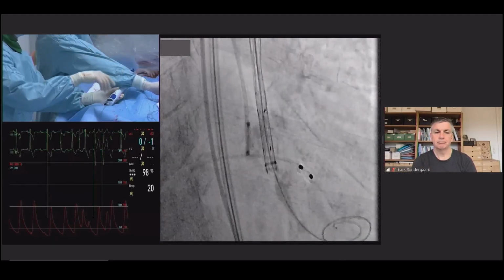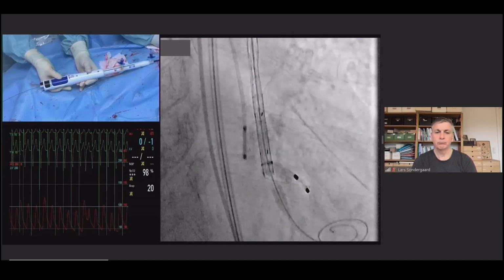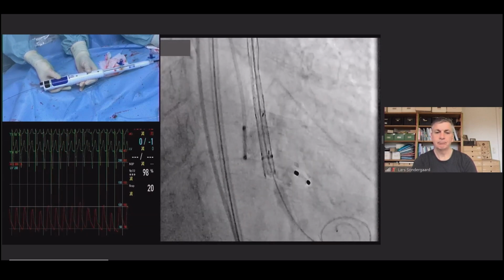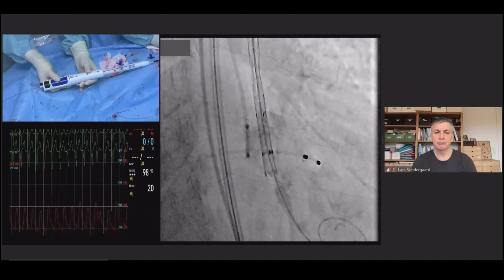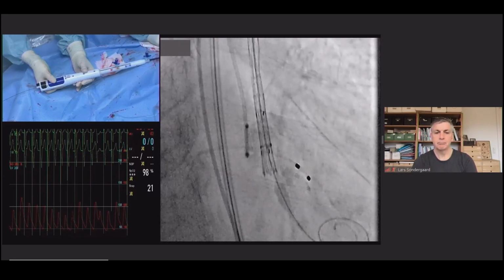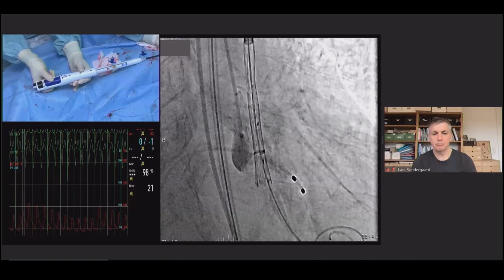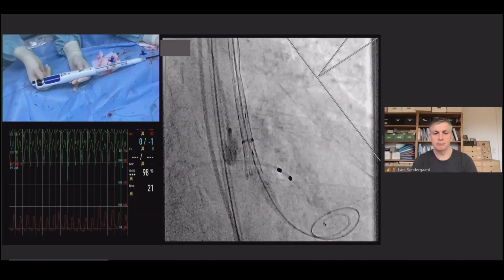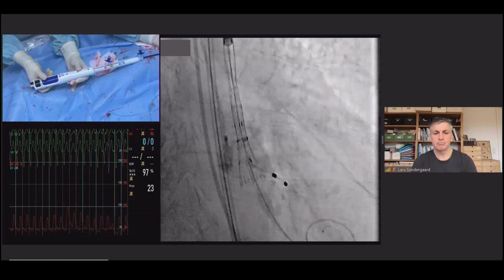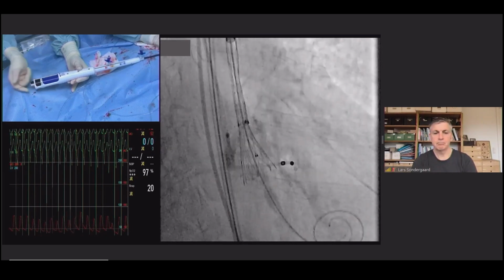Okay, that's fine. Just continue pacing here, and we'll pace a little bit faster when we come to the middle phase where the stent frame is flaring out, before we get annular contact. So you can go up to 130 here. One small contrast injection, you can do that. I think that's okay. Again, remember you have all that calcium below where the pigtail is sitting. Just stay on that pacing. You can go up to 140. Continue.